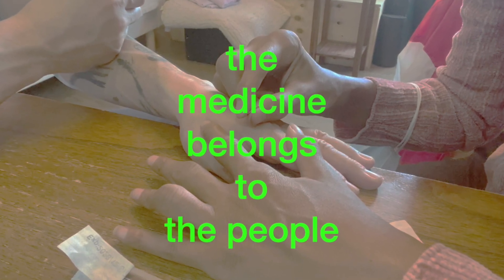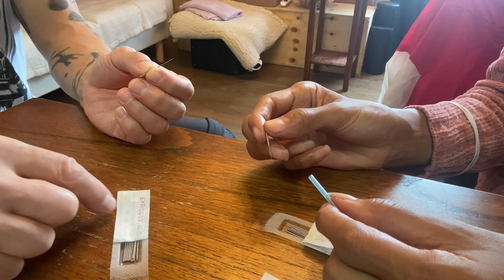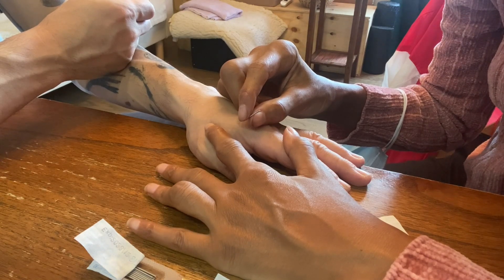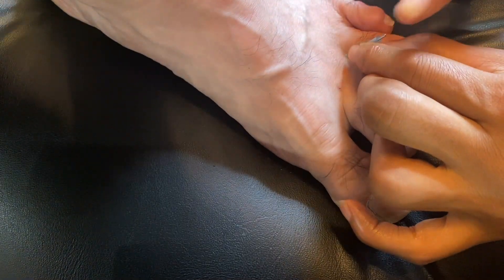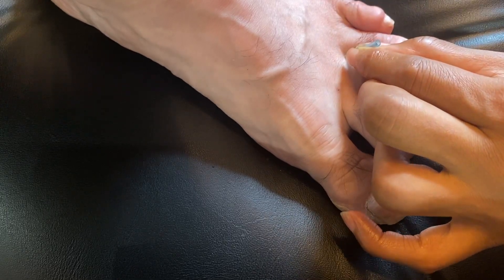Keep in mind the blister pack is what's called a clean field, so if you keep them in here they're still technically sterile. Now insert it down into the muscle — this kind of technique — and give it a good firm tap. That's not what I would call a firm tap.